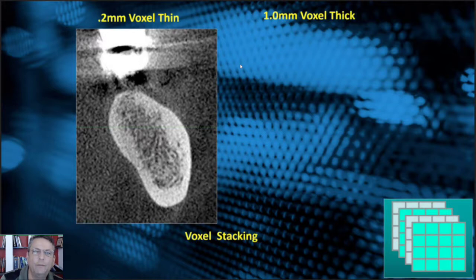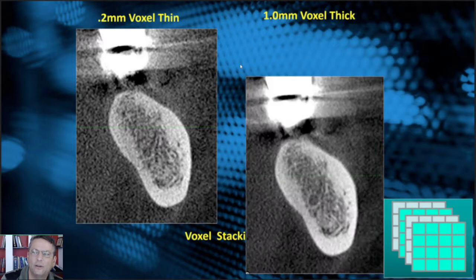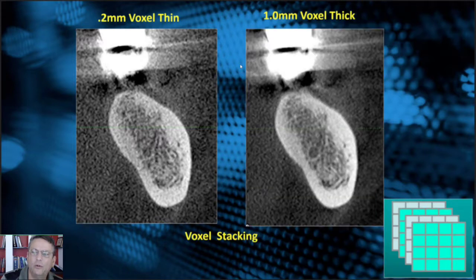Here's a 0.2 millimeter voxel thin slice. If we stack the slices, we want to be able to see the canal and the edge of the bones. All I've done between the 0.2 millimeter voxel and the one millimeter voxel is stack the slices. See how you can see the nerve canal very cleanly now — the other one looks a little noisy. So these are just a few hints to help improve your software settings.